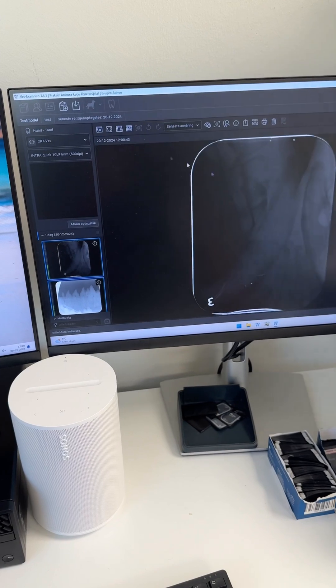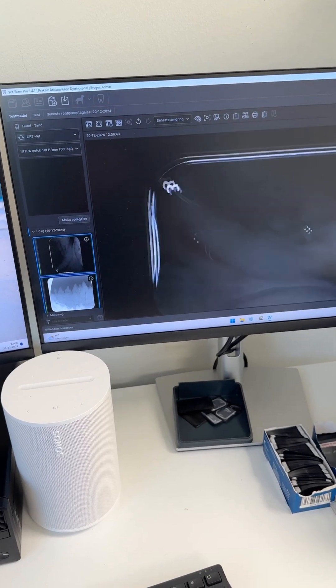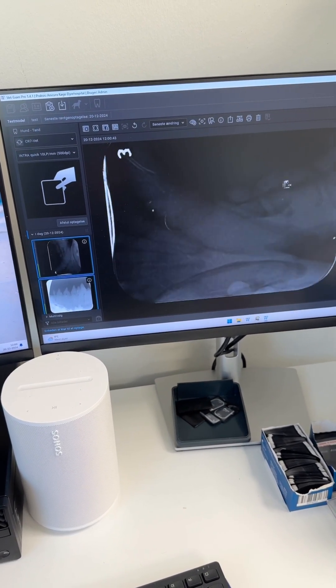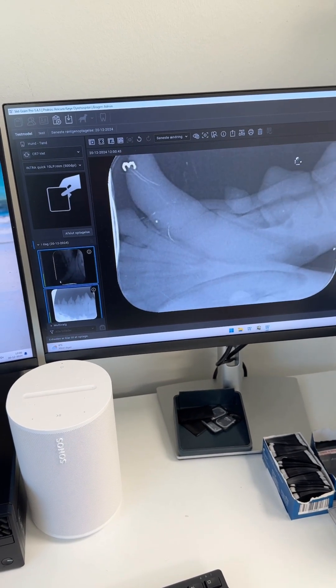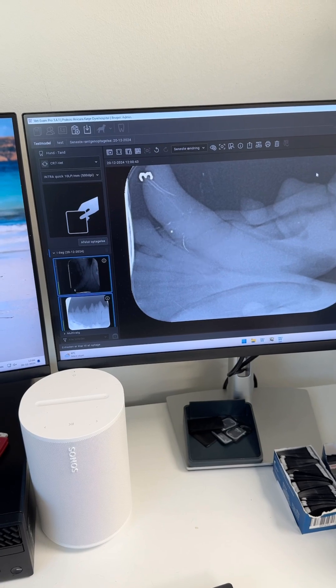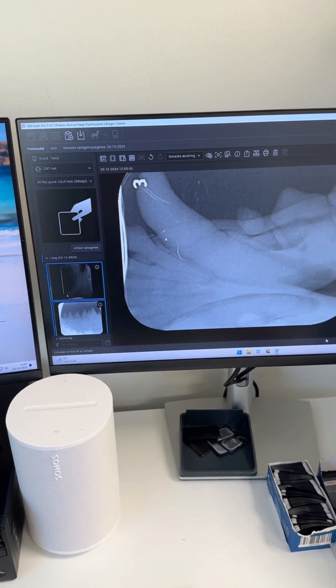You can see you can easily practice positioning with this model, and you can even see the outline of the tooth, the periodontal ligament, and so on.